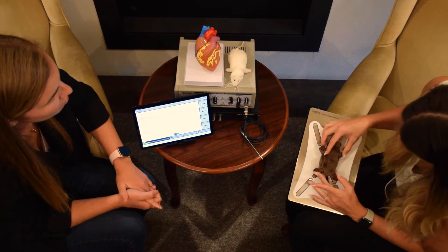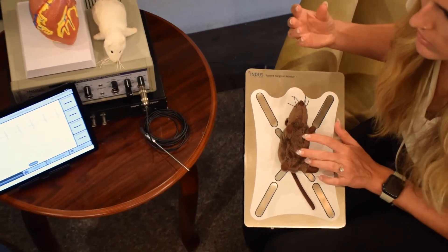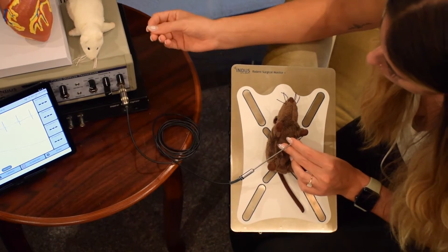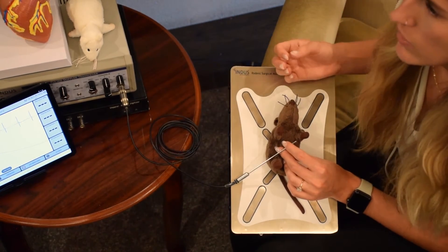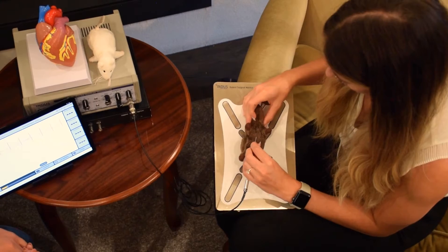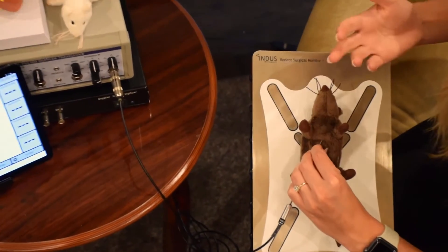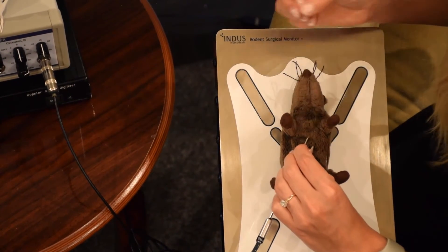Once they're taped down to the platform, with an anesthesia nose cone if you're using gas anesthesia, we take our Doppler probe. All of our settings are done on this transceiver here, and we adjust according to the depth we need the sound to travel — dependent on the size of the animal and which vessel we're targeting. For example, for the mitral valve, we place the probe just underneath the ribcage and angle toward where the mitral valve would be, adjusting the depth on the transceiver to achieve the optimal signal.